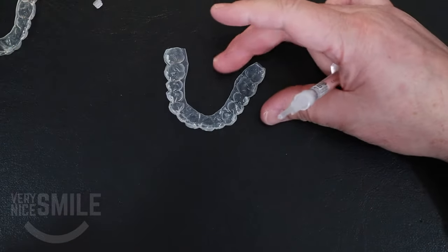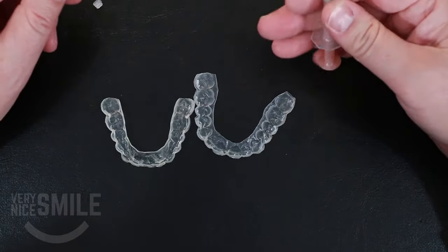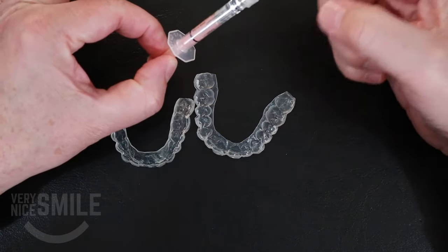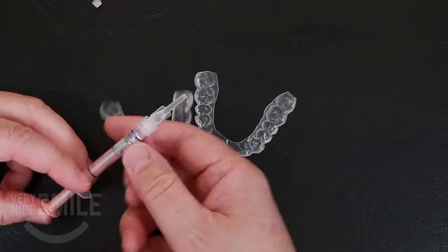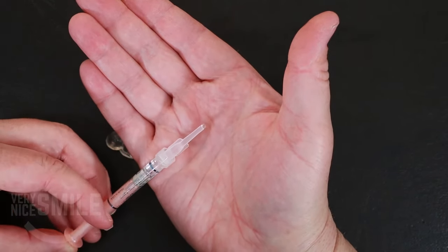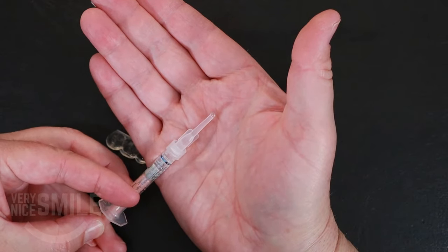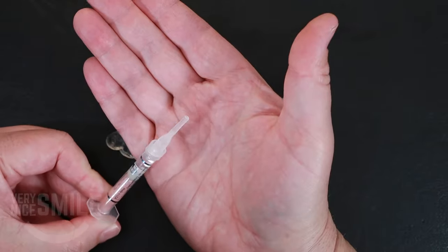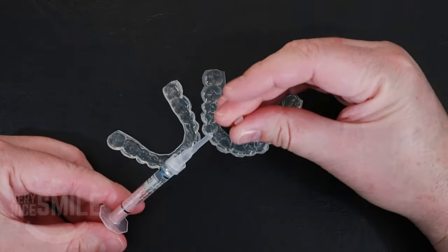Now that both trays are loaded, you want to pull back on the gel syringe to suck the gel back in. You can see the gel oozing out — pull back on the syringe and it goes back into the syringe. Then you can put the cap back on it.